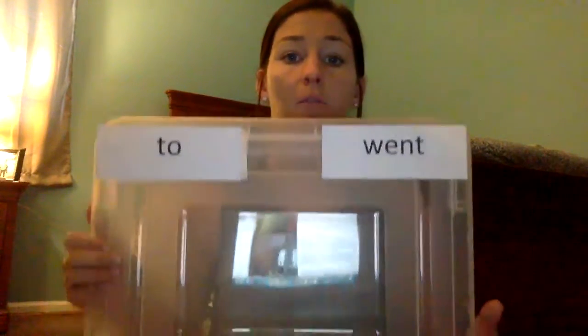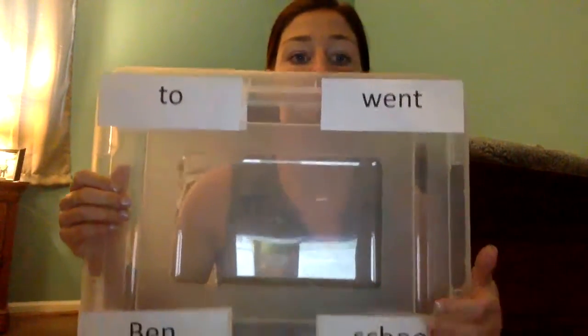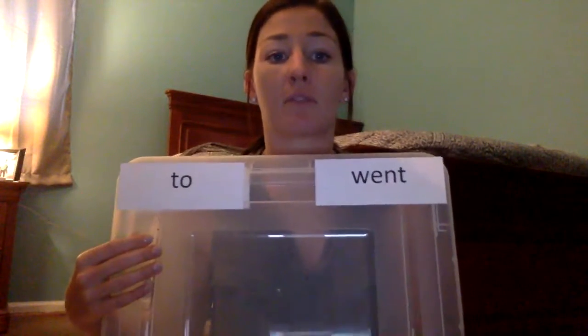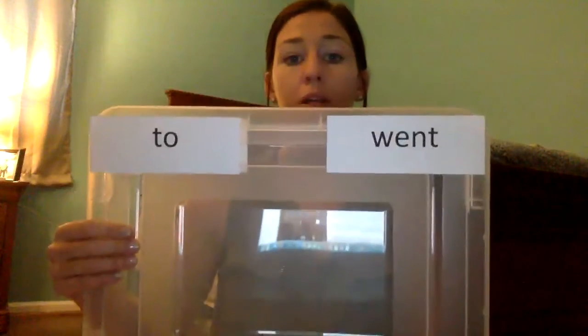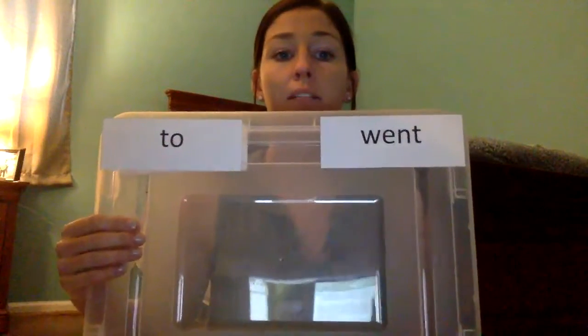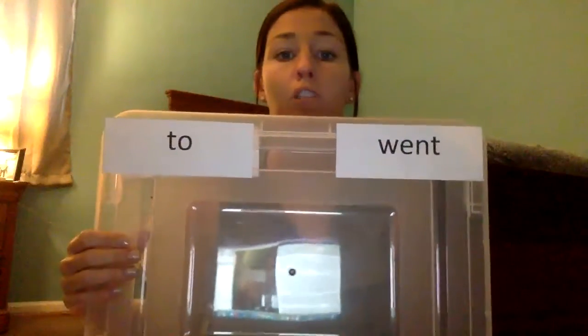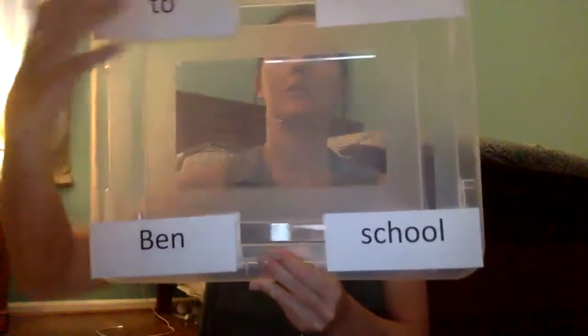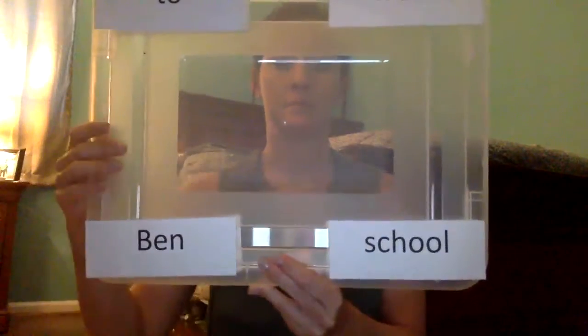As you can see, there are 4 words on this device. Cognitively, John can understand directions; he is merely prevented from verbally answering. The instruction would be, formulate the appropriate sentence with these words. I would follow his eye gaze and the movements to motion the accurate order of the words. In this example, I would be looking for Ben went to school.